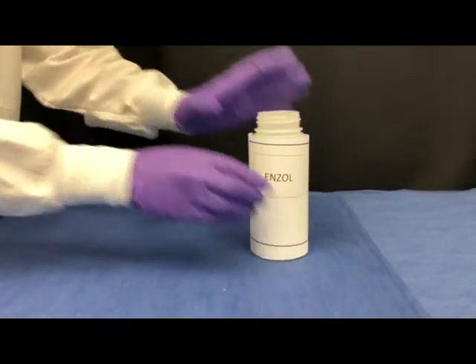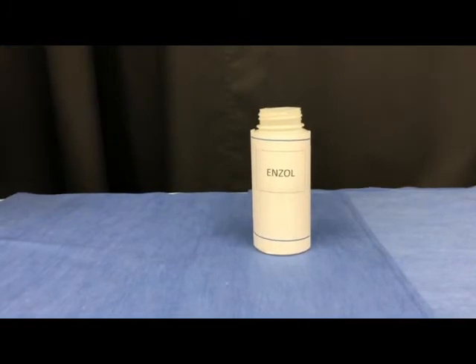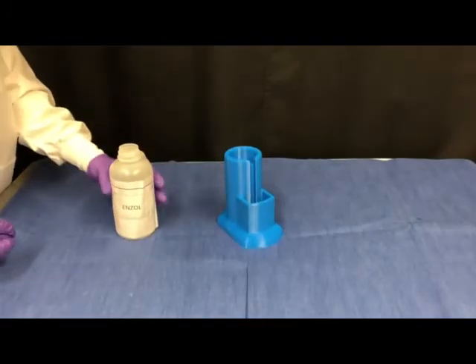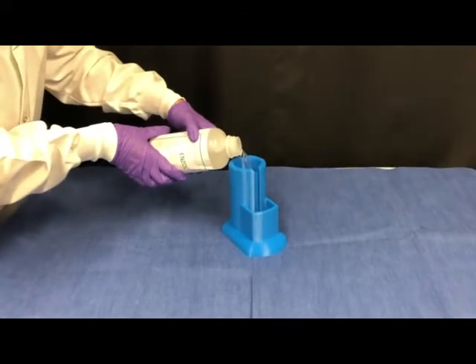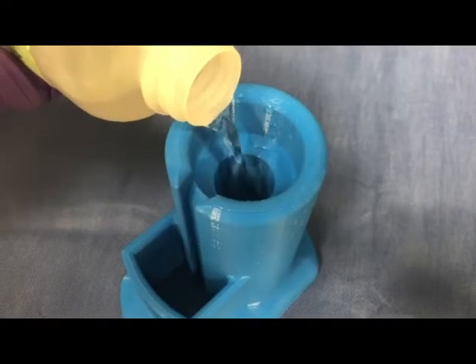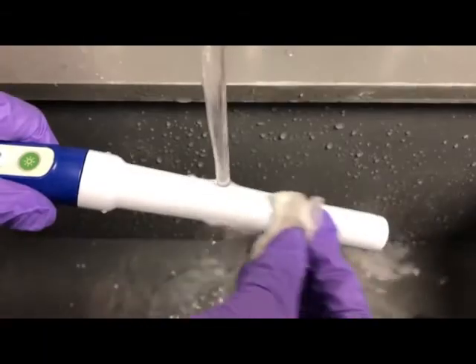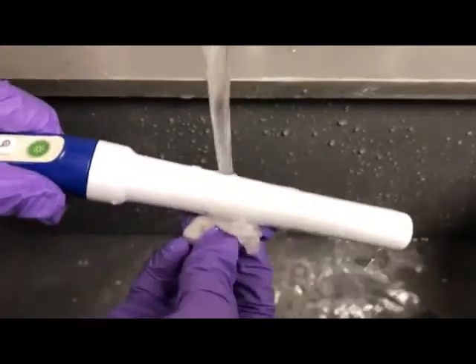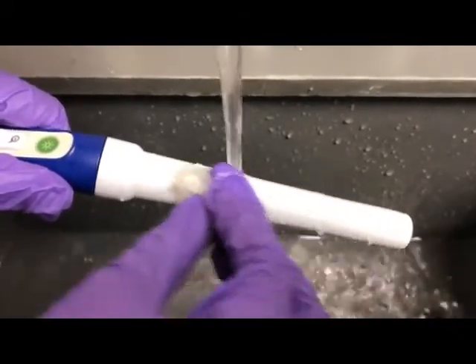Prepare an enzymatic detergent such as Enzol, Biozyme, Clenzyme, Mirtazyme, or Empower, according to manufacturer's instructions. Fill a soaking container with the enzymatic detergent up to the appropriate level so that when the probe is inserted, the fluid will rise to, but not above, the submersion line on the probe. Rinse and gently scrub the probe with a clean, lint-free cloth under running water until visible soil is removed.